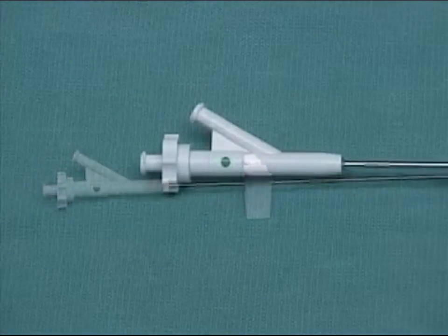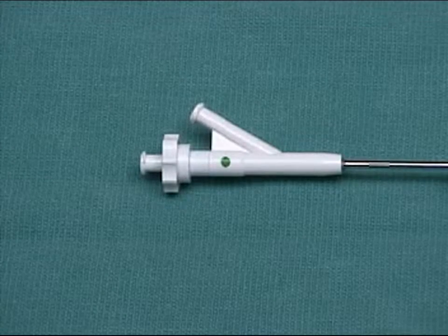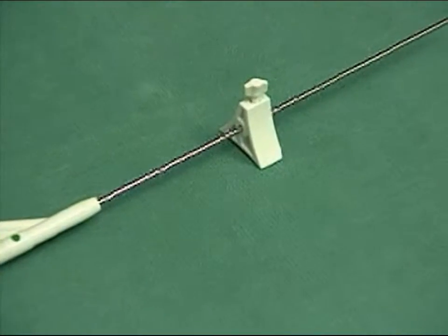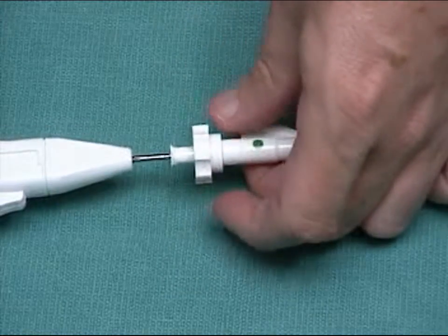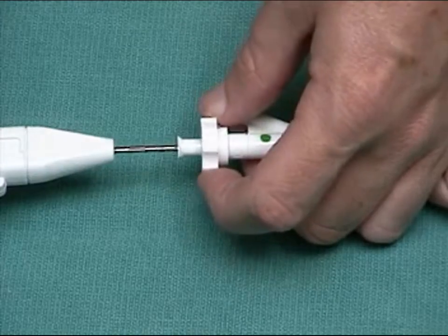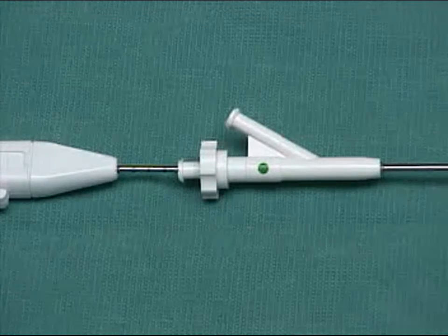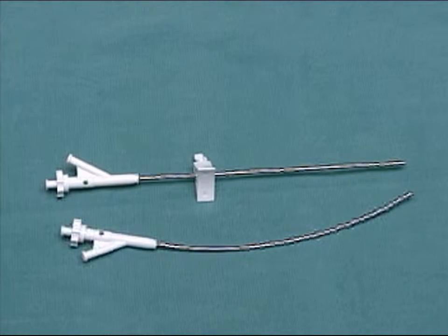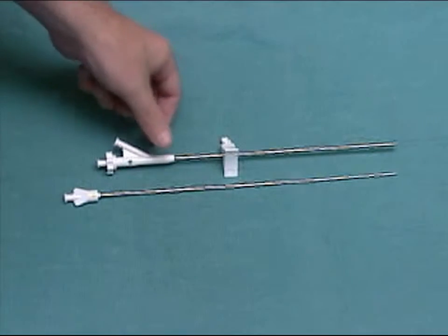The LASE endoscope is placed into the disc through a working channel. Identify the working channel by its green dot. A triangular skin stop helps secure the working channel against the patient's skin. The working channel has an aspiration port for removing the saline irrigate. You can loosen or tighten the working channel's grip on the endoscope shaft by turning a compression fitting.